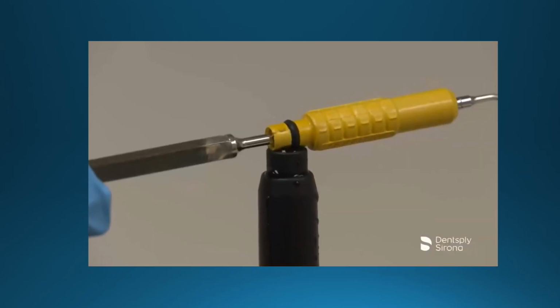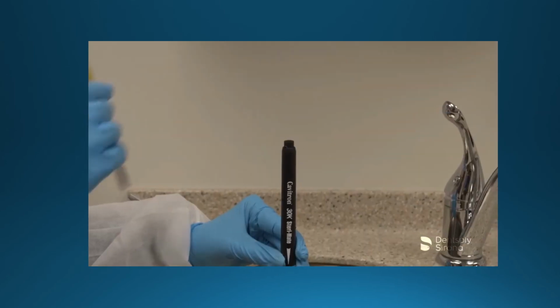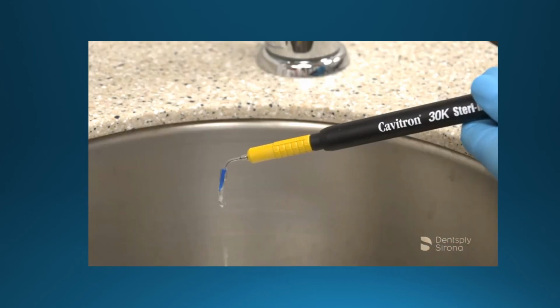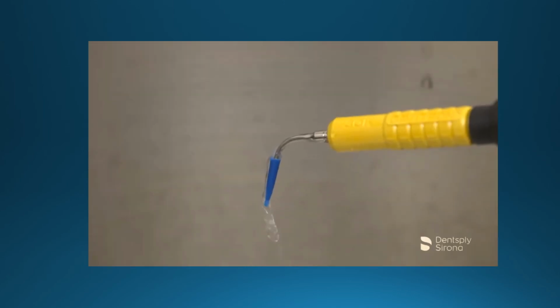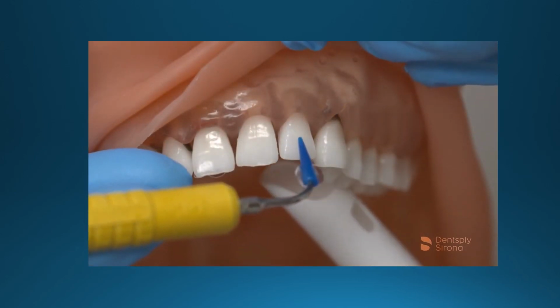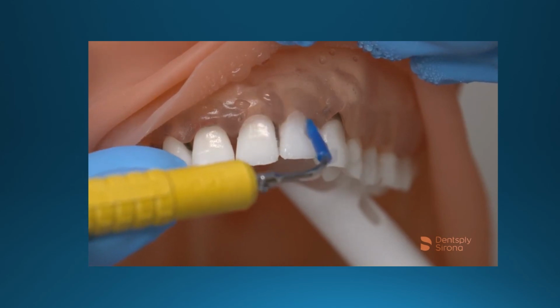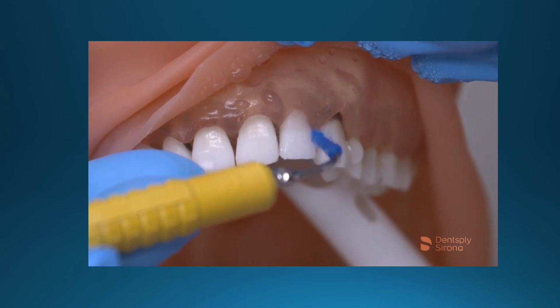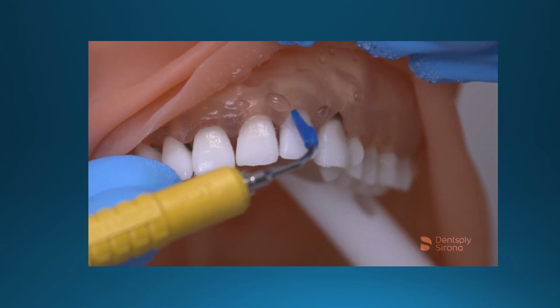After the clinician has placed the soft tip disposable prophy tip with the wrench included, filled the handpiece with water, seated the insert, selected the power, and adjusted the water flow to obtain a fine spray, instrumentation begins according to the treatment plan prescribed for the patient. Dental implants and their titanium surface need additional consideration when choosing the proper debridement instrument. The sulcular environment and the mucosal seal is more fragile than the normal tooth, and this requires a gentle approach and care when debriding the sulcus.